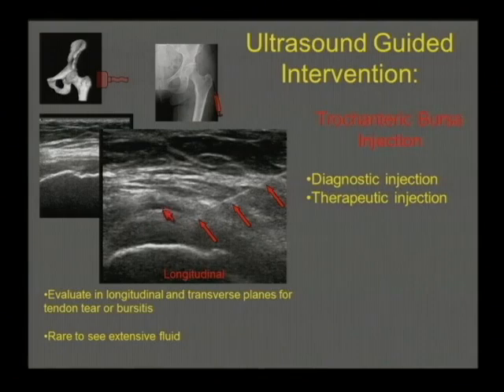So if the patient does have a little bit of fluid, as in this case, it works really well. You can guide the needle tip right to the margin of where the greater trochanteric bursa lies. Often I'll do that with some anesthetic along the whole course of the needle. Once you get into the bursa, you'll find that there's a loss of resistance. You can inject fluid and see the anechoic anesthetic flow freely in that bursal plane. Sometimes even a bubble or two will get in there, and again serves as an additional visual cue that you have the needle tip right where you want. I'll leave the needle there, take that syringe off, put on the steroid, and do the injection in that location.